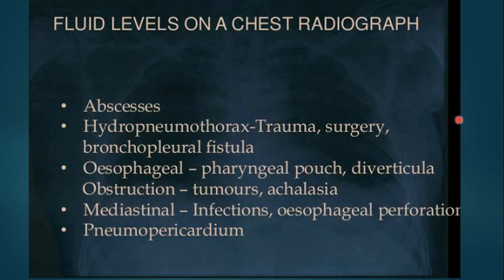So, what are the causes of fluid levels on a chest radiograph? If you see a chest x-ray with air fluid level, what could be the cause? Of course, according to the shape of the lesion that contains the air fluid level, according to the location, according to the number of the fluid levels, according to the clinical history, always, always, the history is very important.